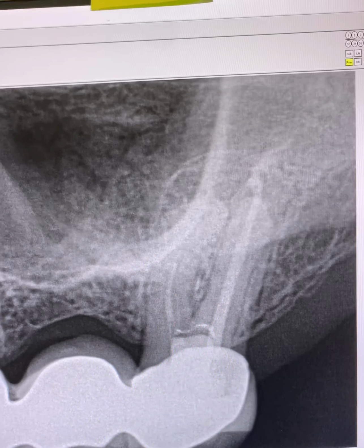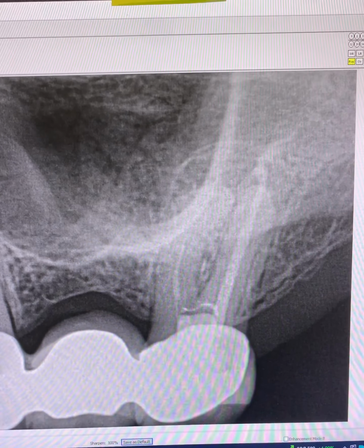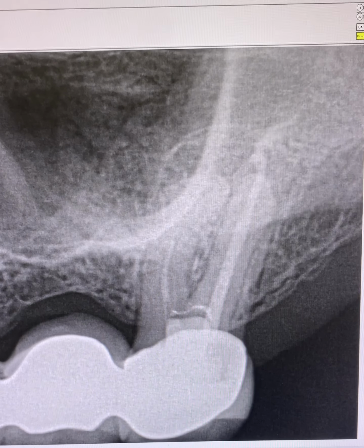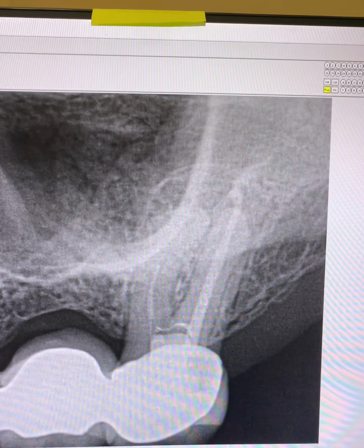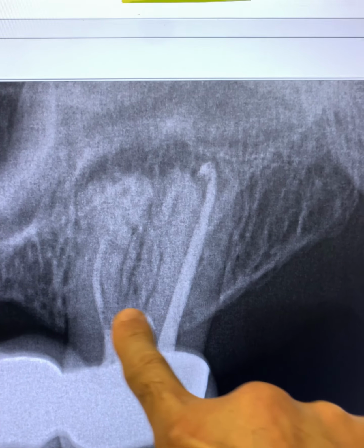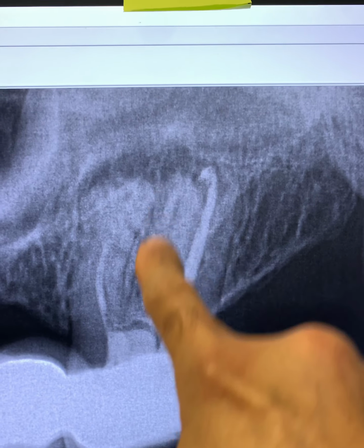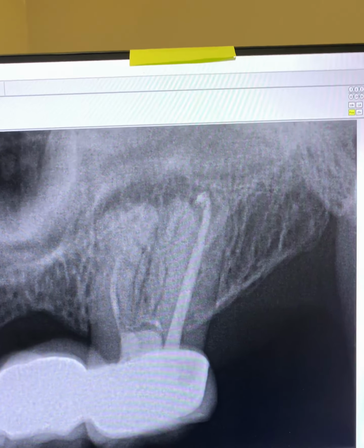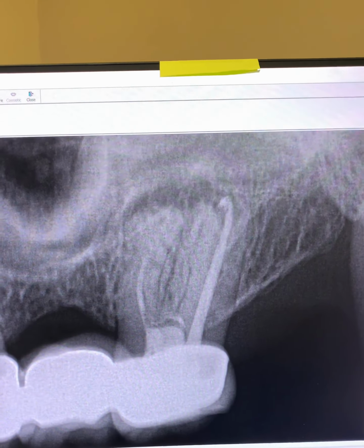You can see that this endodontist gouged the pulp chamber floor so much, hoping that he would find that distal buccal canal, and he could not. He couldn't find it. You can see how much gouging was done here. Look at that periapical radiolucency there. But the distal buccal is somewhere around here, but this endodontist gouged the heck out of this, removed so much dentin basically to try to locate that distal buccal canal, and he couldn't.